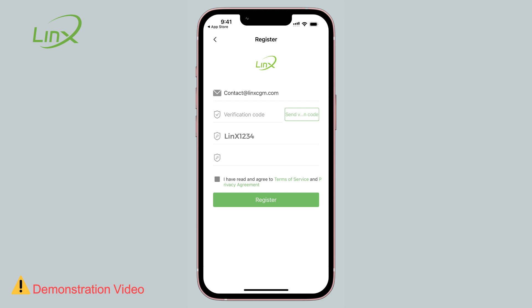The password must include an uppercase letter, a lowercase letter, numbers, and be in English with at least 8 characters. Afterward, press SEND to receive the verification code.